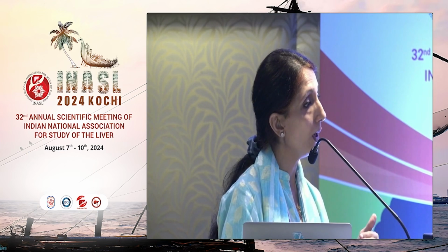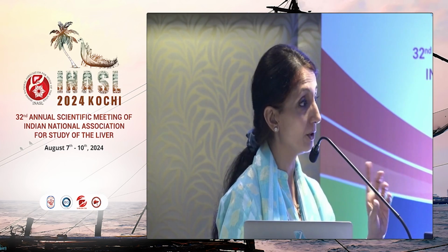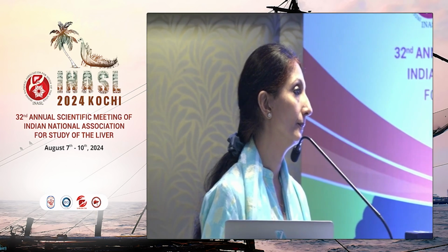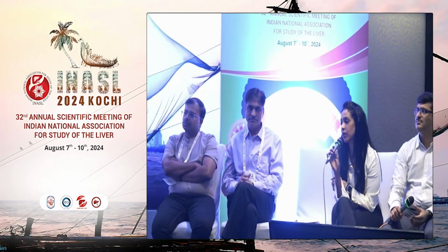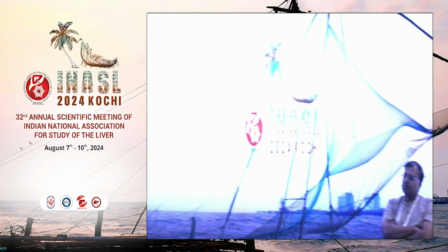But to follow up a potentially benign versus malignant lesion, to follow the change from benign to malignant, I would not use it. For diagnostic purposes, let's say you want to differentiate between inflammation and malignancy, is it useful? It is useful, but eventually it's the enhancement pattern, because that's the tissue viability that you want to see. So it is an add-on, but it is not the end-all.